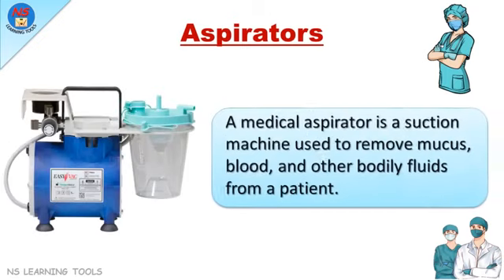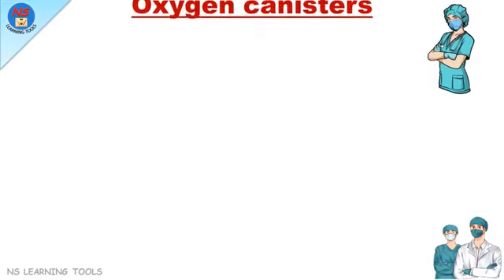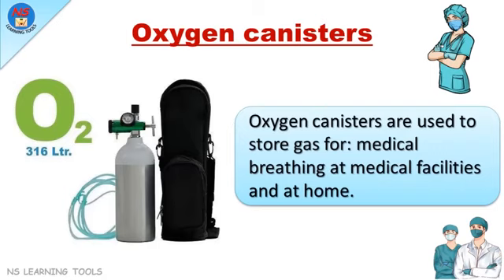Aspirators. Medical aspirators is a suction machine used to remove mucus, blood, and other bodily fluids from a patient. Oxygen canisters. Oxygen canisters are used to store gas for medical breathing at medical facilities and at home.